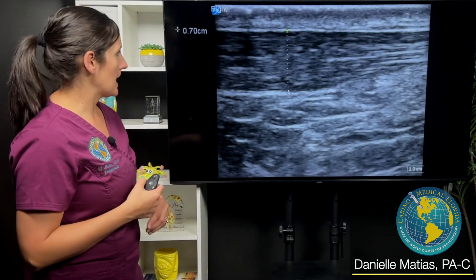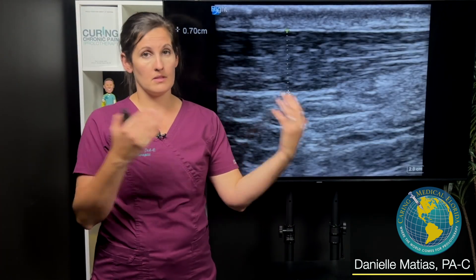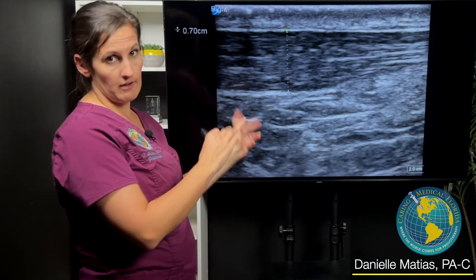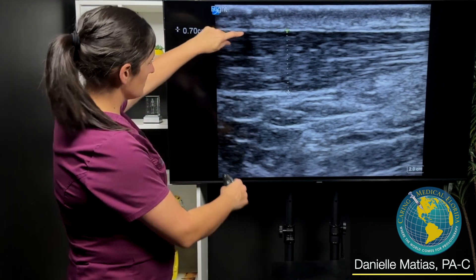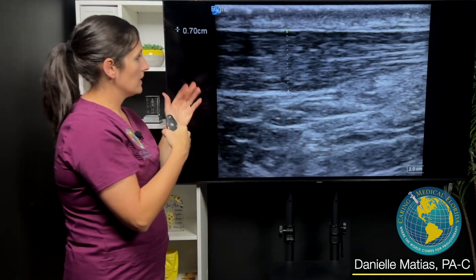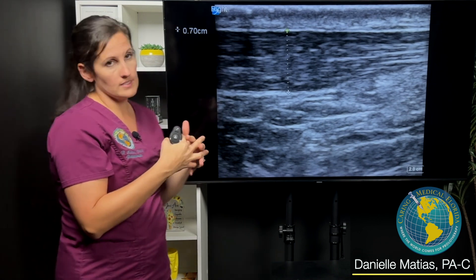We use ultrasound to evaluate the injured Achilles tendon, and I oftentimes will ultrasound the other side just to compare. This is his good side — the right side. That measurement you see is the Achilles tendon, and on his right side it was measuring about 0.7 centimeters.